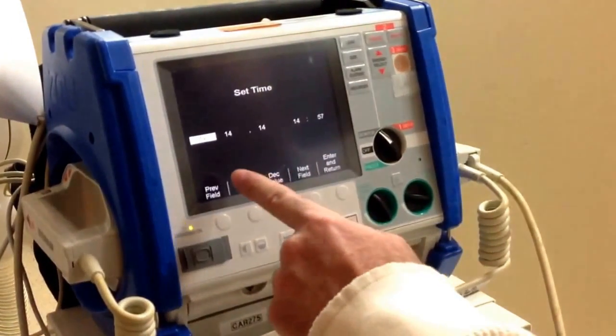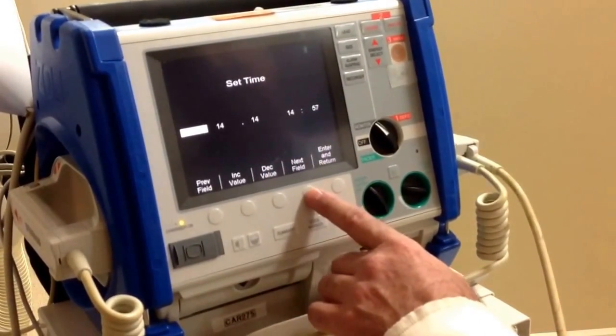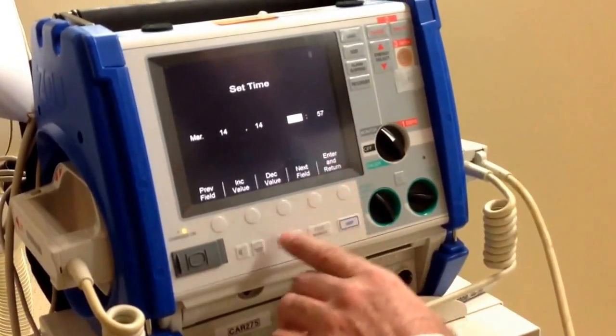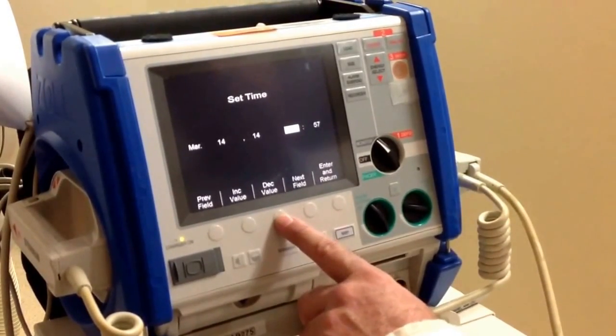The screen comes up highlighted with the month. Scroll through the month, date, and year until you get to time by pressing the soft key that says next field. You can increment or decrement the hour by using the increase value or decrease value soft key.